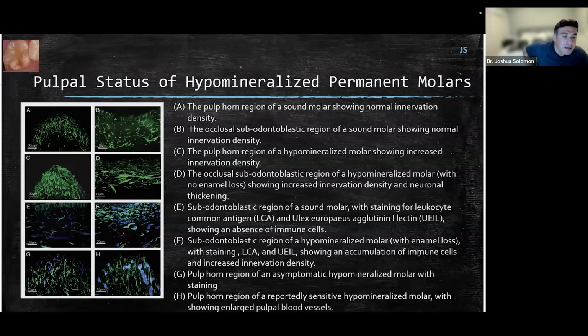If a tooth is constantly inflamed, just like we know soft tissue that's inflamed, it's harder to get numb. You require either a much greater volume of local anesthetic, which there's only so much you can give with a block, or you need to be able to give targeted delivery. And that's what we're giving with intraosseous anesthesia. We are literally giving that injection maybe millimeters away from the nerve itself. You need to coalesce as much local as possible to basically bathe that tooth. If you think about the root, you want to bathe that root in local anesthetic in order to get that tooth that's in this hyper state of hyperalgesia all the time.